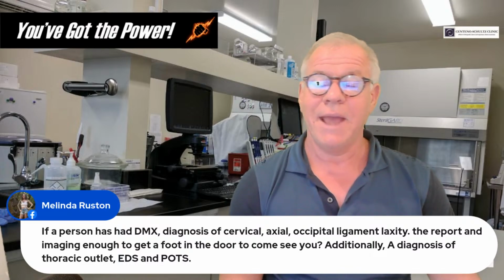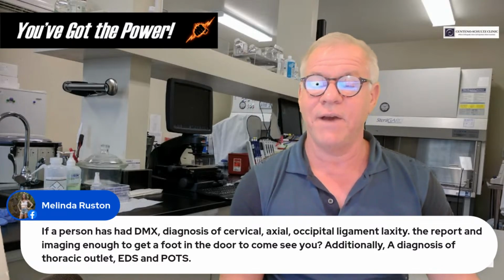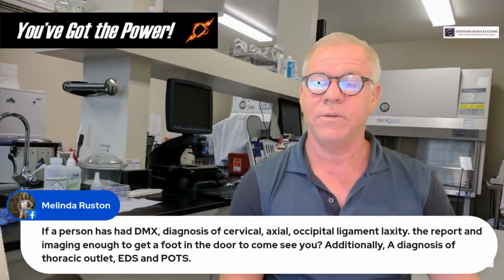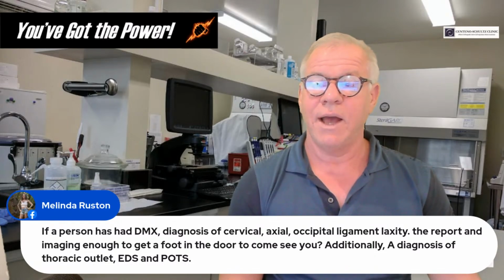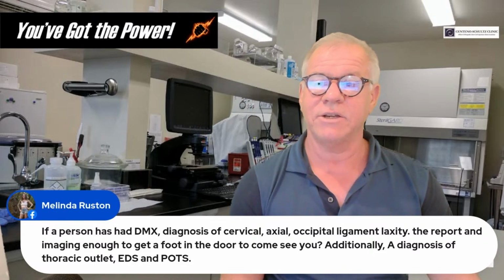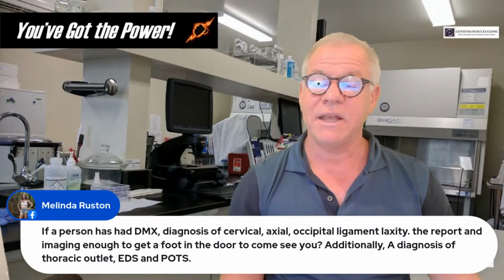I'd be happy to look at it personally. I don't trust DMX reports all that much. I find that they tend to be written more for medical legal purposes than actual medical diagnostic purposes. So I read all the DMXs myself, and then actually even double check the measurements on the DMX. But having a DMX is great.